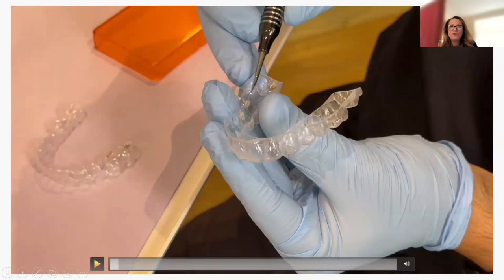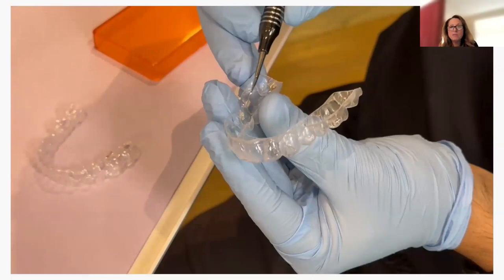Okay, so if you're using a flowable, you want to make sure that you keep the tip in your attachment area when you're expressing that out. You don't want to overfill it, you don't want to underfill it.